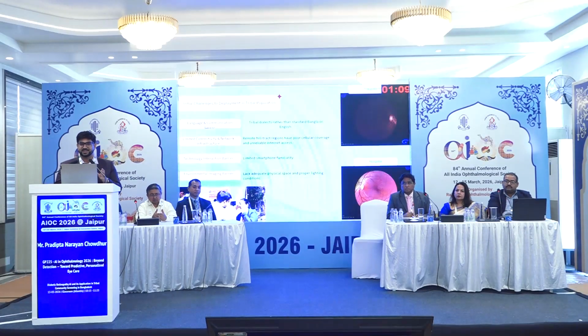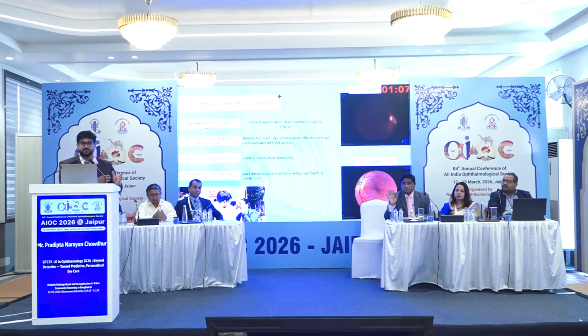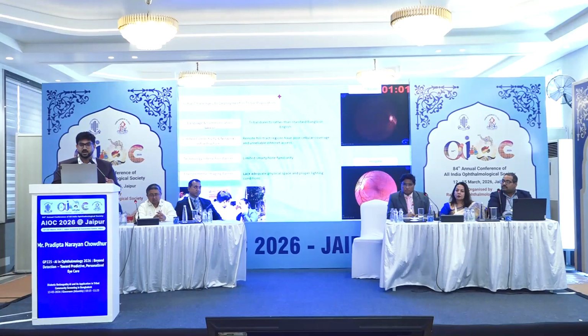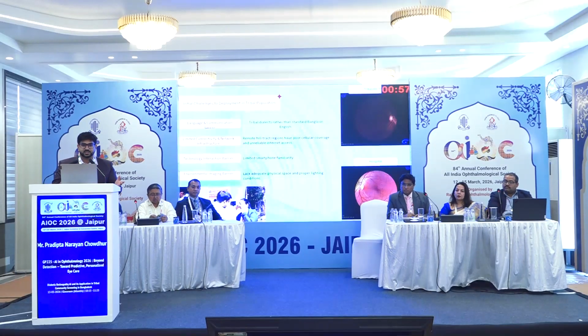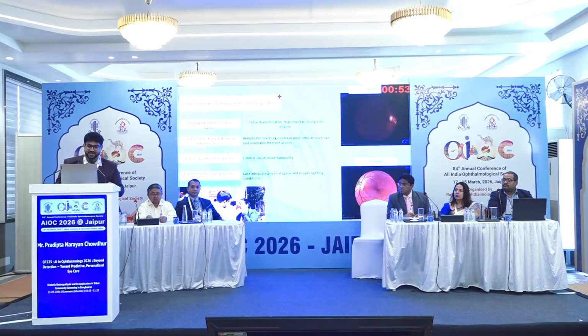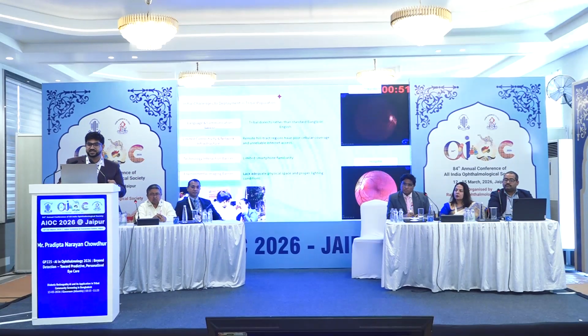We're saying we're building the AI, we're putting it in the smartphone for the accessibility of the patients. But if the patients don't know how to use the smartphone, which is very much the case with our baseline study in the Bangladesh rural areas, then all of this is for naught. All the thousands of dollars that we spent on the AI just comes to naught. And finally, the environmental imaging barrier.